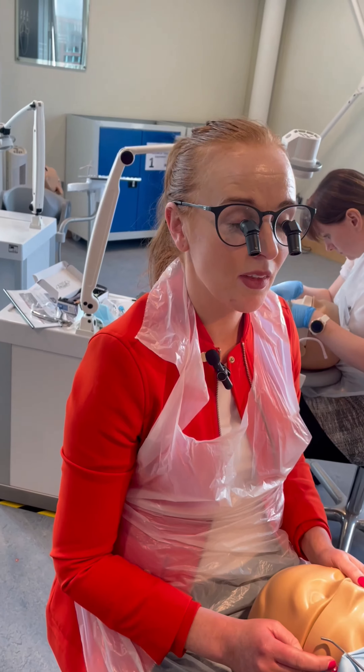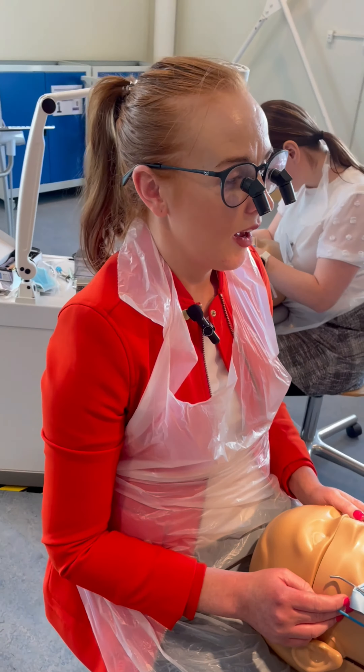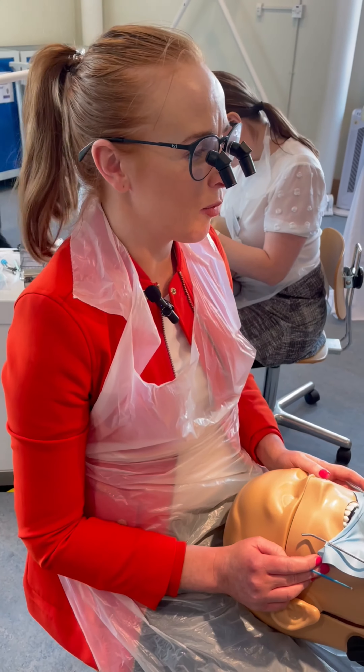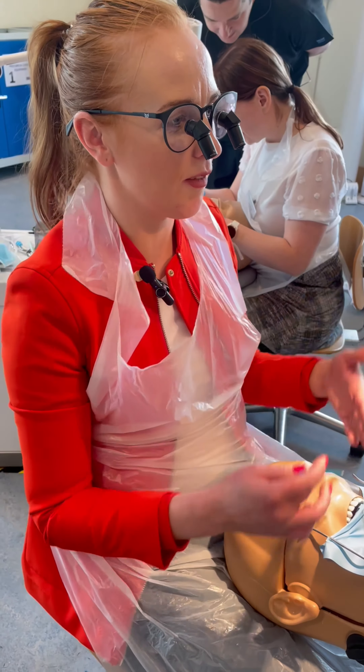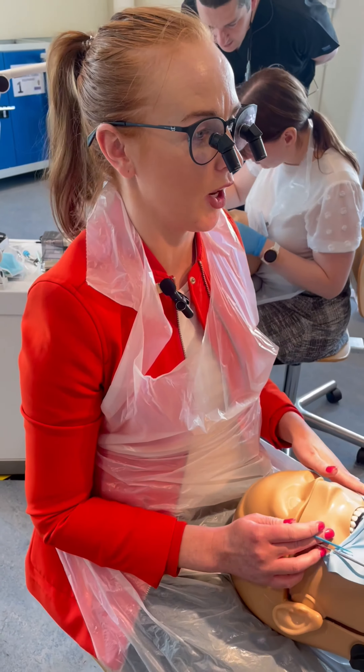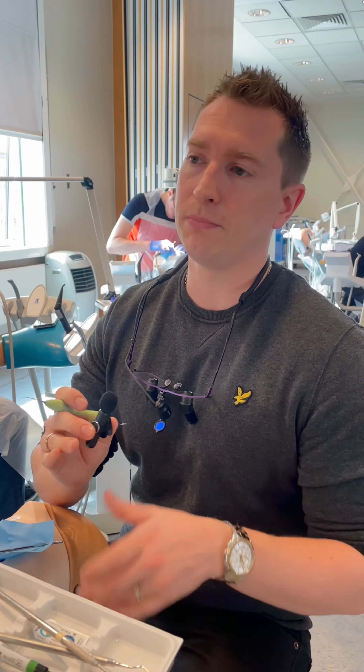Do you think you'll be able to adjust to them quite quickly once you've had a bit of practice? I hope so — they actually feel more comfortable than I thought, to be honest. I feel really straight up, which is good. I started with them on the end but now I've changed to using them for everything, and I can't even do scale and polish without them anymore. They've changed absolutely everything when it comes to dentistry.